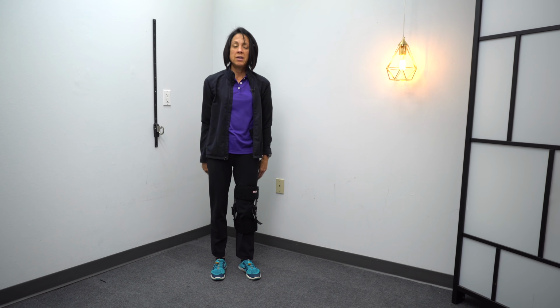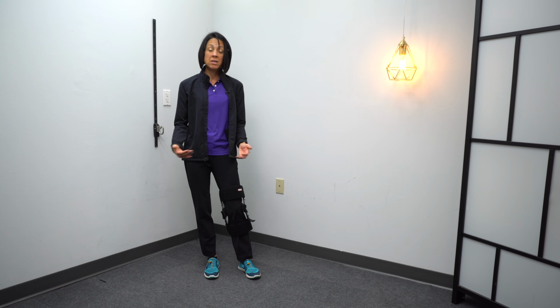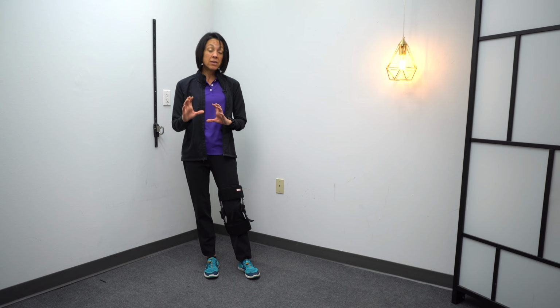When you can do that, your walking will become more automatic without you having to think so much about keeping the knee unlocked. So the first line of defense is an AFO with a plantar flexion stop. I think that's the best way to do it because with an AFO you can control the ankle and the knee.